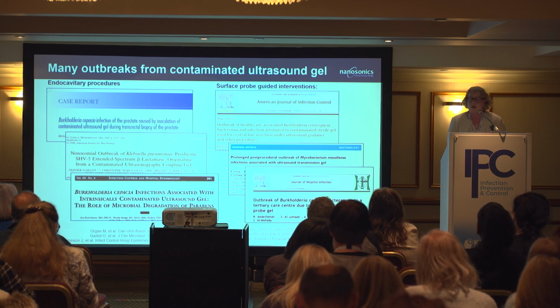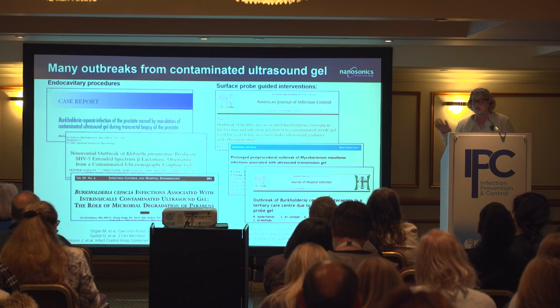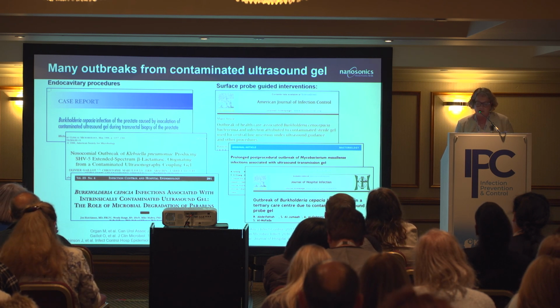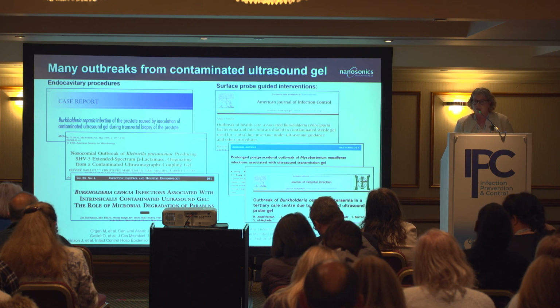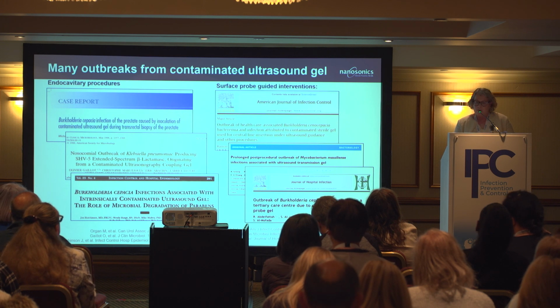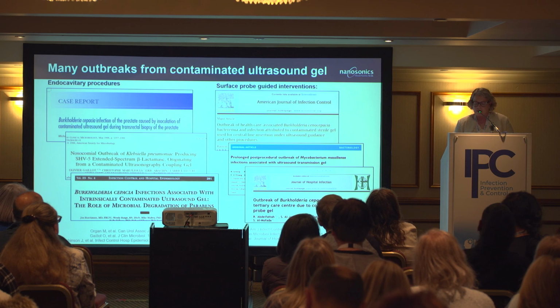Today, across Europe, I think it's only the UK and France that mandate sterile gel, and there's tons of evidence to demonstrate that actually sterile gel is definitely where you'd want to go. So multi-use ultrasound gel bottles should never be refilled, for example. So managing that ultrasound gel, but actually making sure it's sterile, would definitely address some of this.